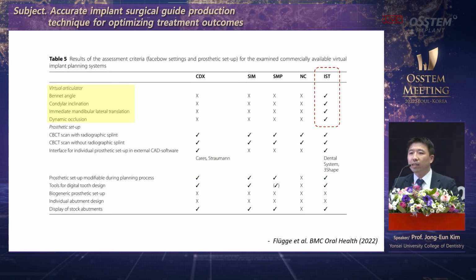Planning software, there are many available. There are different functions available. Depending on the software that you use, you need to understand which functions are supported. On the right is Implant Studio.